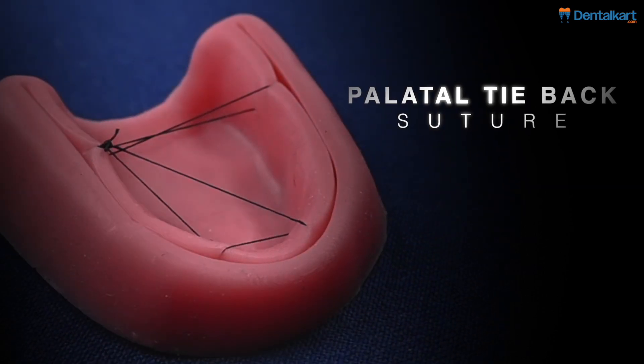Hi, I'm Dr. Uday. In this video, we will be learning about a palatal tie-back suture.